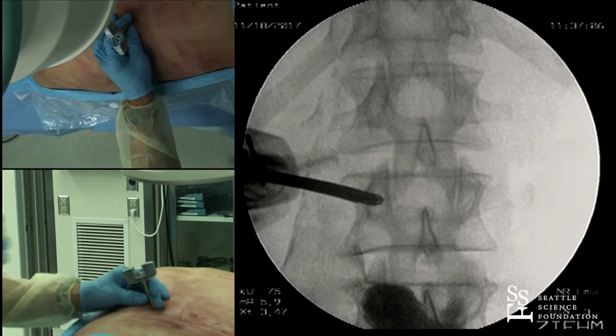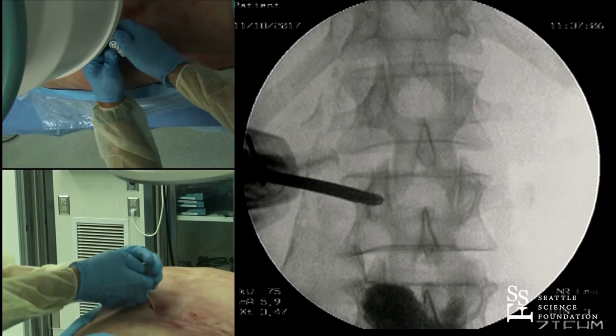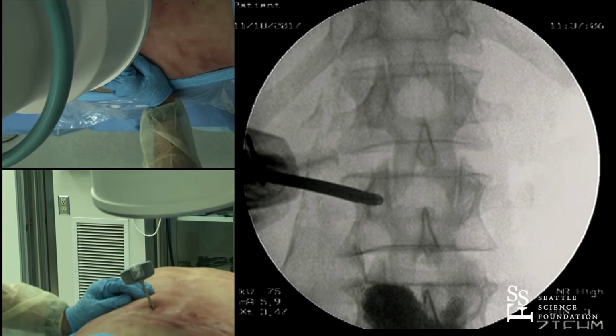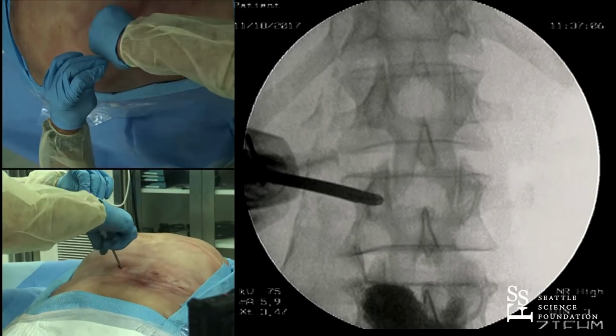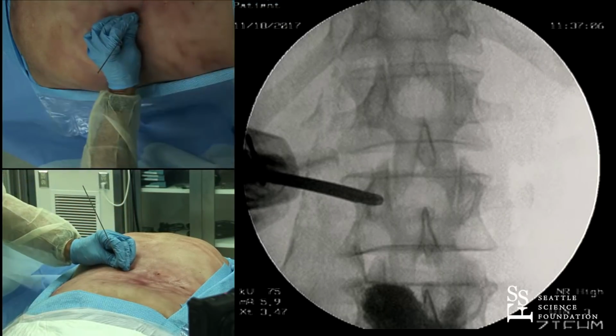So put this back in. So go ahead and swing back lateral if you would. I'll take that K-wire back. So what he's noticing is that the trajectory is more vertical than he wants, and he wants to angle a little bit more so he deploys toward the center, because this trajectory is approaching the lateral wall of the bone.